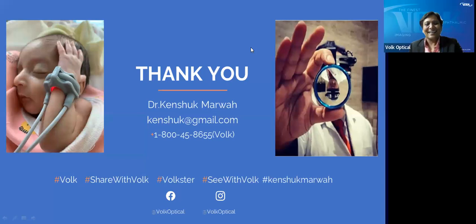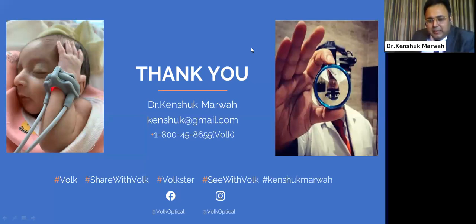And how to clean the lens? Like I have already shown in my slides, for cleaning the lens you should have distilled or non-ionic water, as suggested, and maybe soapy water. You make a froth and then clean it with a lint-free cloth.